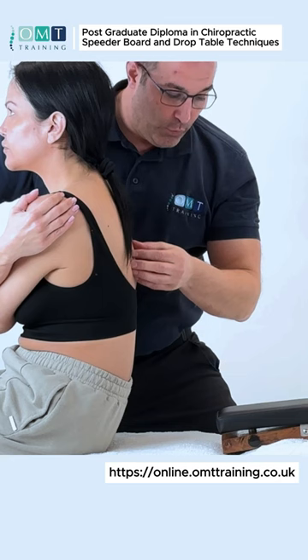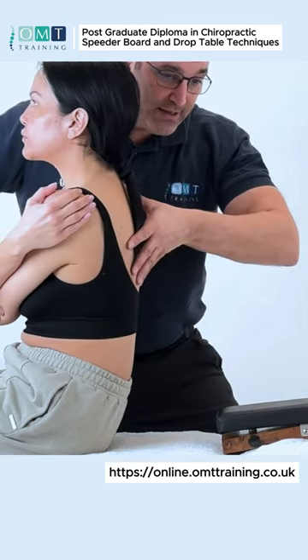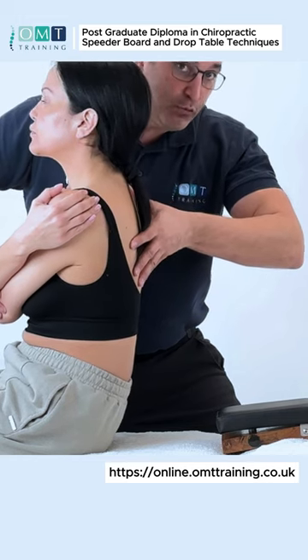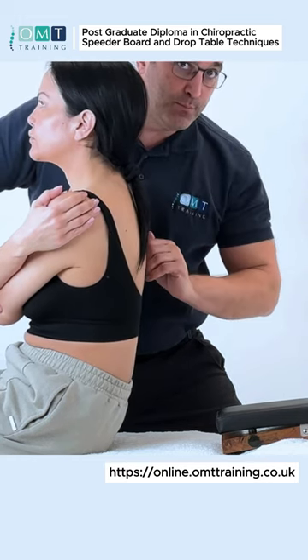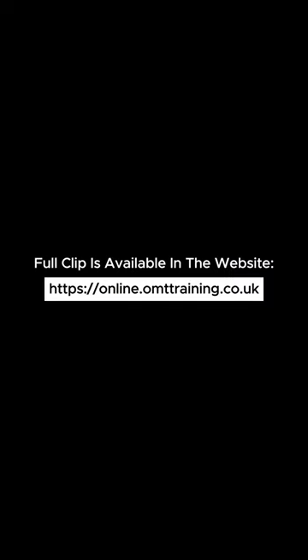What you're aiming for is the target area to meet the board. Once it meets the board, you can add a gentle push through the elbows, and you'll hear the board move. So the patient on the exhalation will go down — they meet.